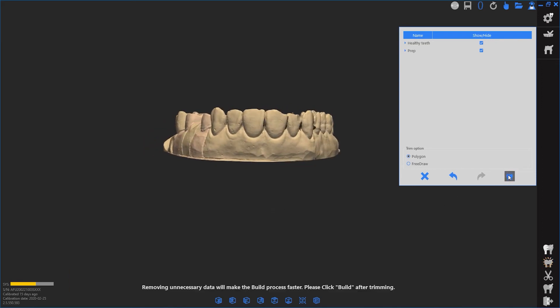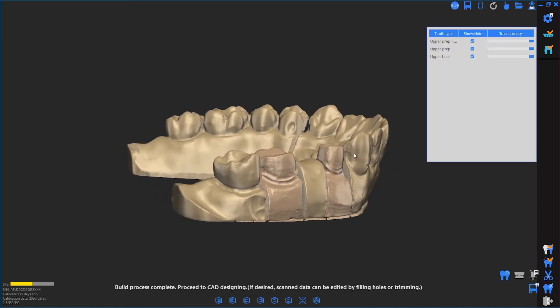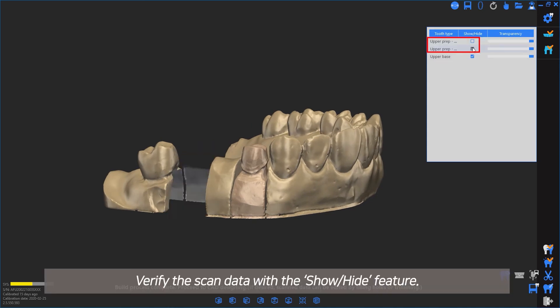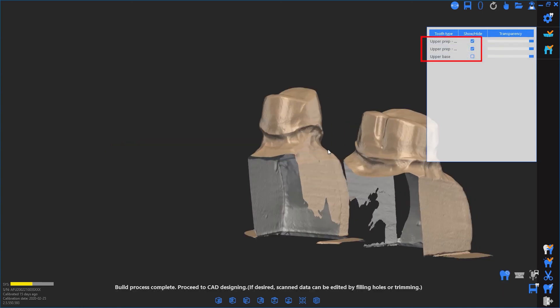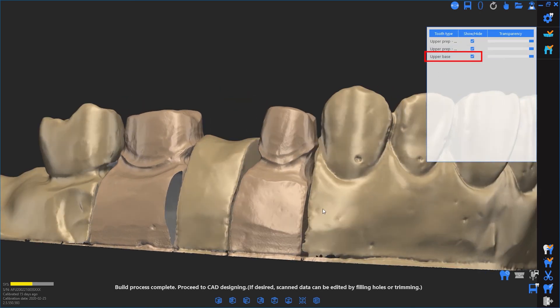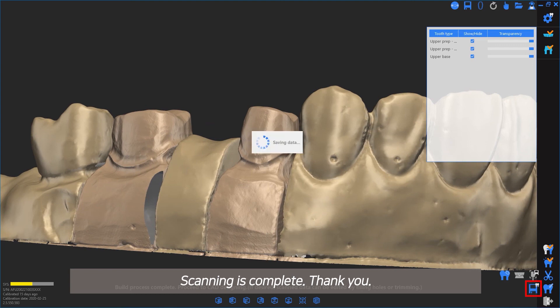Continue with Build. Verify the scan data with the Show/Hide feature. Scanning is complete. Thank you.